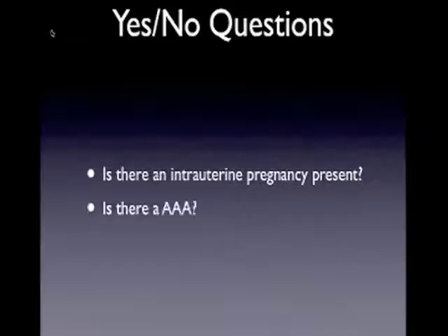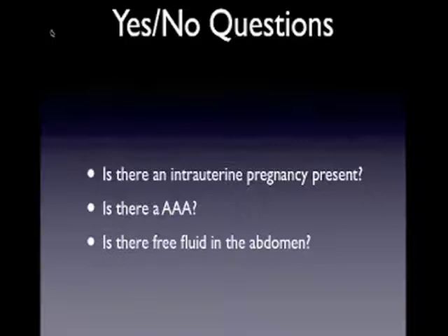Yes or no? In a trauma patient who presents with hypotension after blunt abdominal injury, we are concerned about intra-abdominal bleeding. Our focused ultrasound question is, is there free fluid in the abdomen? Yes or no?